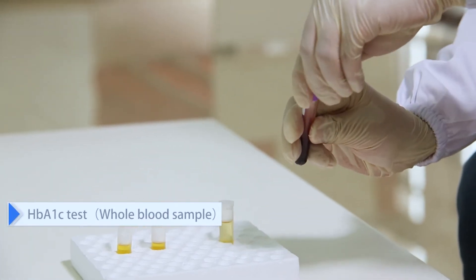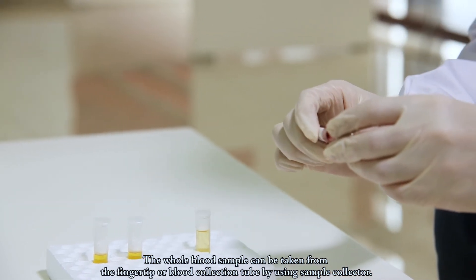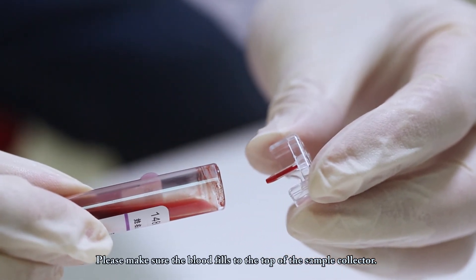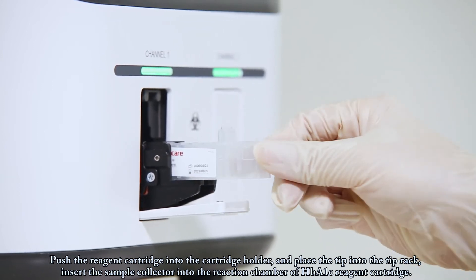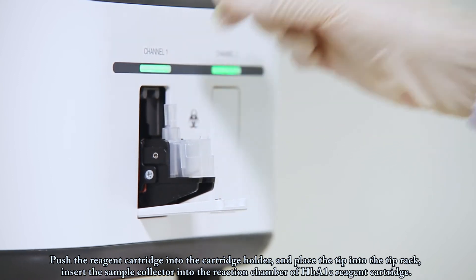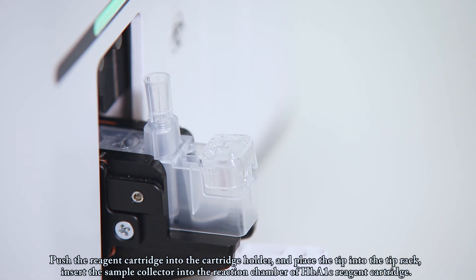For the HbA1c test, the whole blood sample can be taken from the fingertip or blood collection tube using a sample collector. Please make sure the blood fills to the top of the sample collector. Push the reagent cartridge into the cartridge holder, place the tip into the tip rack, and insert the sample collector into the reaction chamber of the HbA1c reagent cartridge.